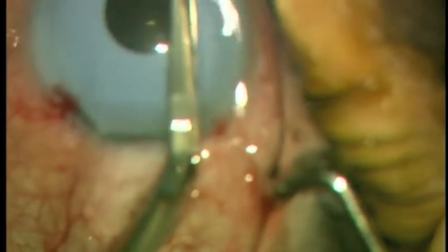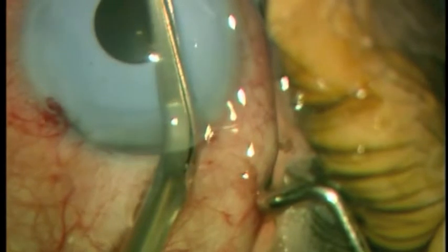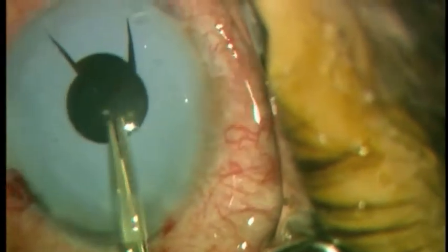Intraocular scissors are used to make two radial cuts in the implant. This facilitates removal of the implant subsequently.